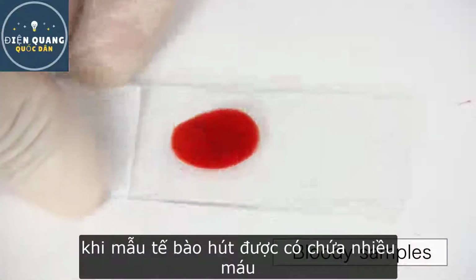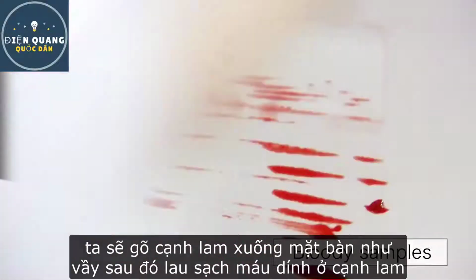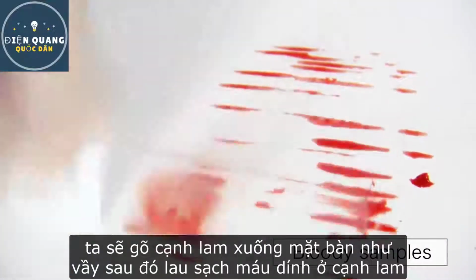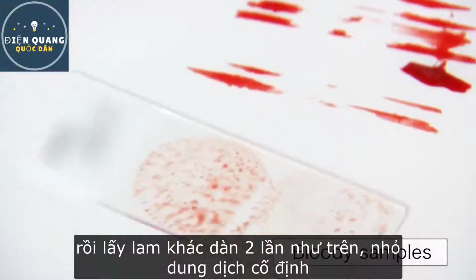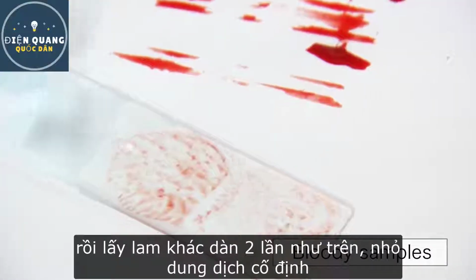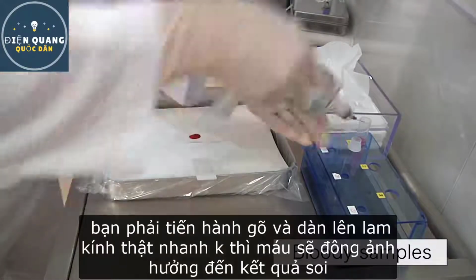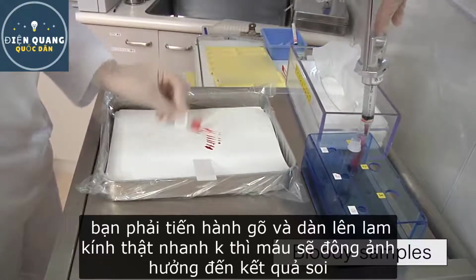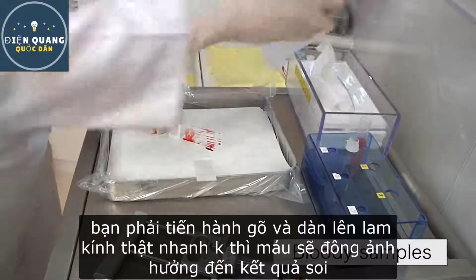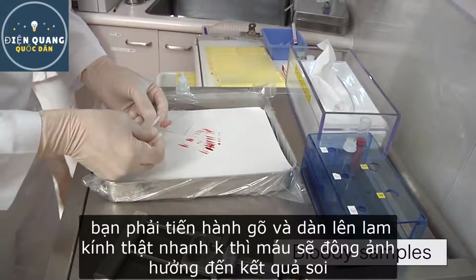When we obtain bloody samples, we tilt the glass slide and slap it. Then we wipe up the components flowing from the glass slide and perform the press and release method. We maintain the adequate cellular components at the originally expressed portion. At the same time, we rinse the needle with fixative for liquid-based cytology to obtain more samples. This procedure should be performed as soon as possible because the blood components quickly coagulate in the needle.